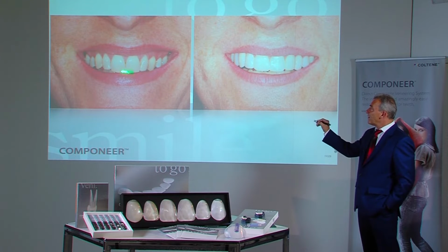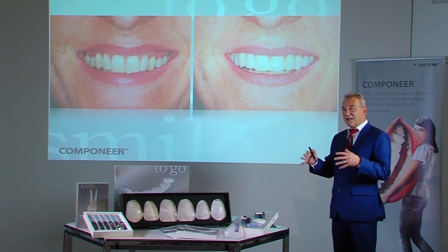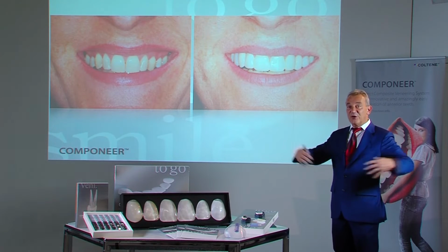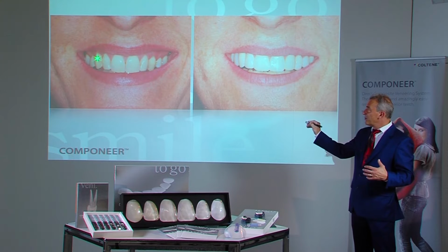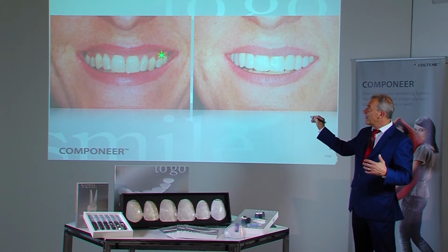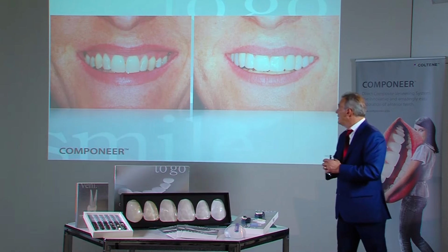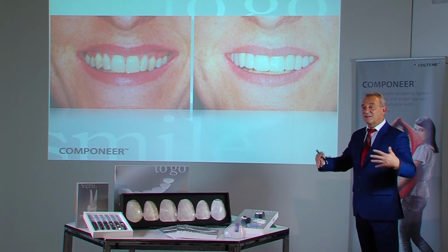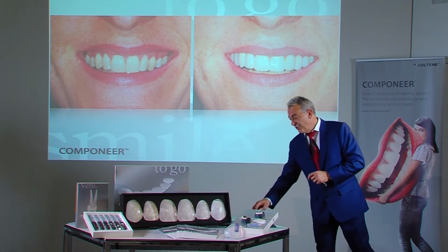And here's the diagnosis again. There are no unattractive teeth. Things are just too crowded. We have an opening lip and the corners of the mouth face outwards. And here we already have the canines. One would normally expect these to be further back. So we have a rather narrow situation. One will need to slightly round out the dental arch to increase the presence of the smile.